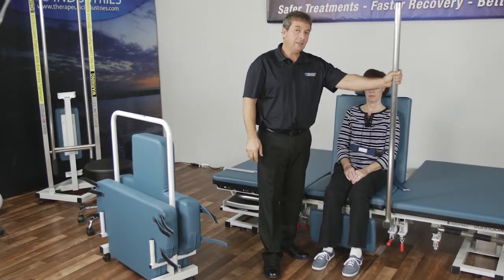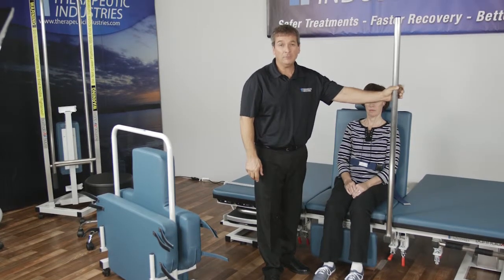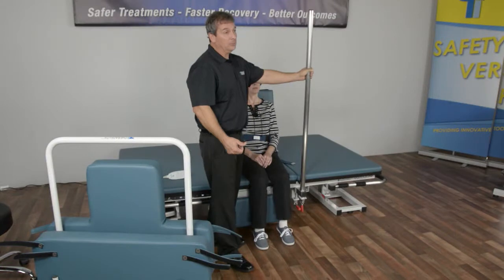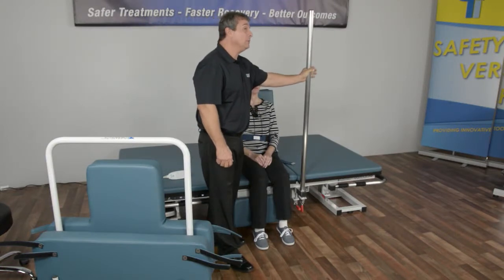This comes really handy whenever you have facilities where their ceilings are very high, so the standing poles either don't reach or they're just not practical. So that resolves that issue.